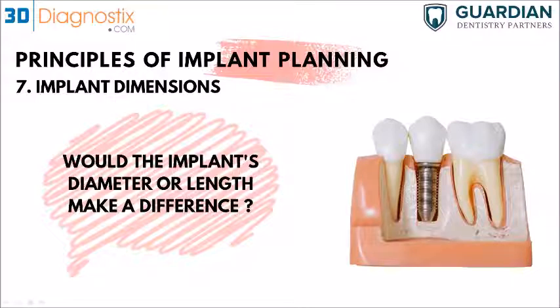But sometimes it's just a problem with clinicians who don't have the guided kit. So what we do basically is we plan the implant virtually to have its apex right at the floor of the sinus. And whether you have the Versah drills or just a regular guided kit, if you go all the way down, then the osteotomy would reach the floor of the sinus. So we plan the bed of the osteotomy to be shy, let's say 1 millimeter from the sinus, and then you'd have direct or easier access to the floor of the sinus, whether you want to use osteotomes, or use the Versah drills freehand. This is going to make it a lot easier for that procedure.